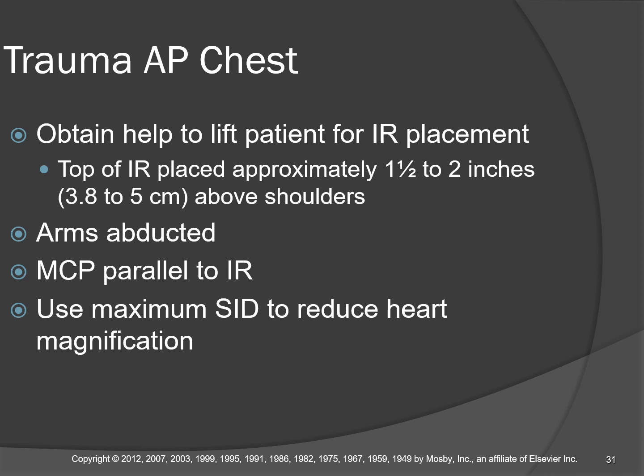So you will need lifting help if the patient's unconscious and they have someone breathing for them. You'll need that respiratory therapist to stay right there and hold the patient's breath on full inspiration. That's a squeeze of the blue football and hold that squeeze in.